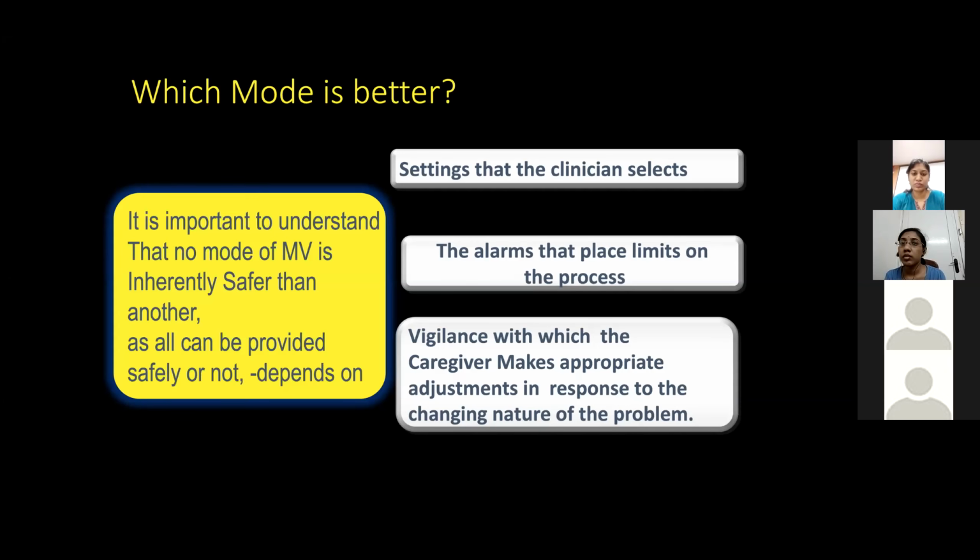And I always say, use familiar skills. Don't go and try, in a situation, APRV for the first time. Always go with volume control, which is much safer.